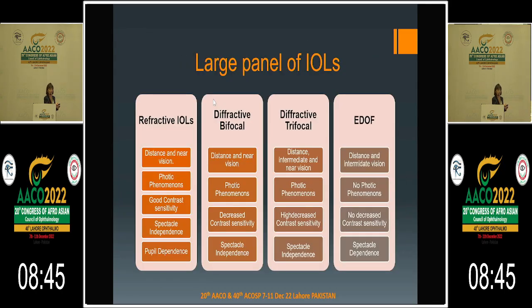Nowadays, as you know, there is a large panel of IOLs available, and patients undergoing cataract surgery have the flexibility to choose one of the different IOLs depending on their ocular structure and personal preference.